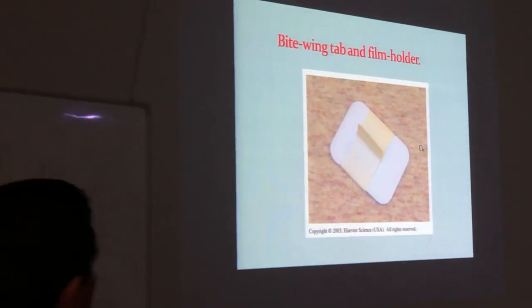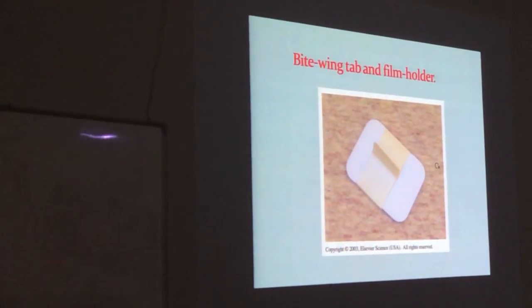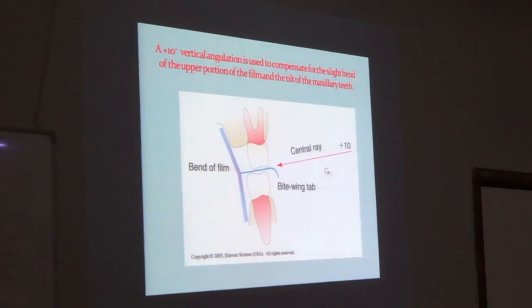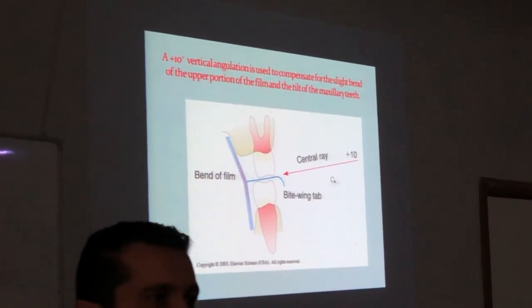Okay. You will bite just only on the extension and not on the whole film. Okay. Just biting on this extension. The film will be on the inner side of the tooth.